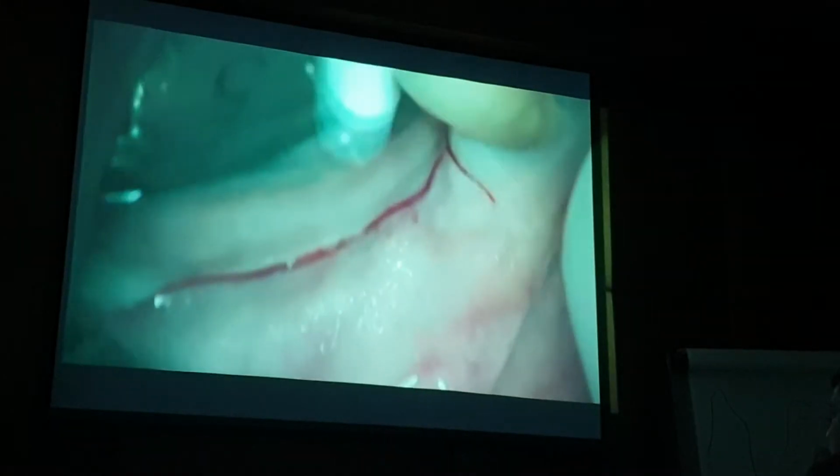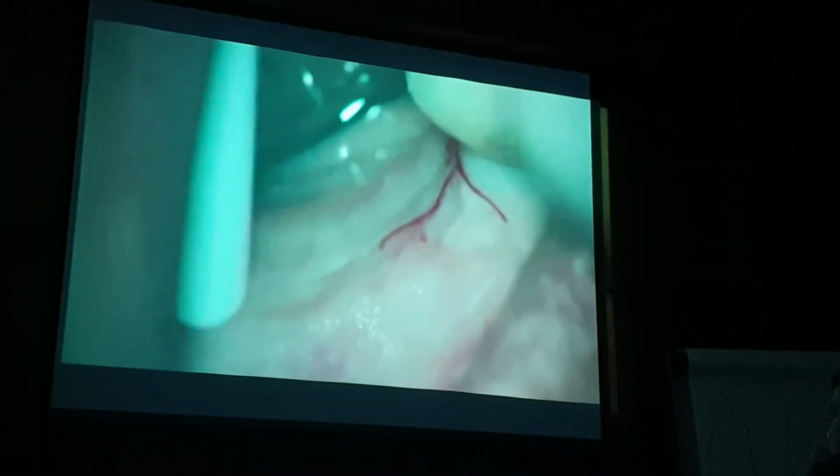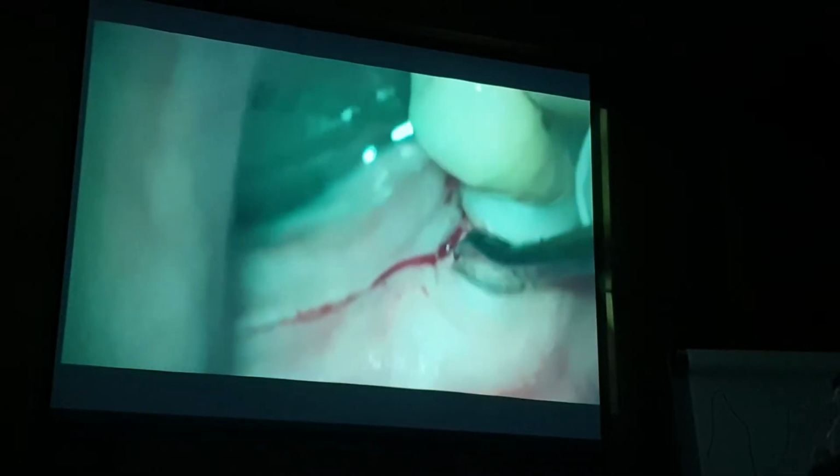The interrupted sutures do. So usually I'll do one at the papilla here, maybe here, maybe one in the center, and the rest of it will be horizontal mattress. And those flaps do not open. Now I'm going to re-enter, and I'll wait 6 months in these cases, where there's a one wall defect with 5 millimeters or more of bone that has to regrow. I'll wait 6 months.